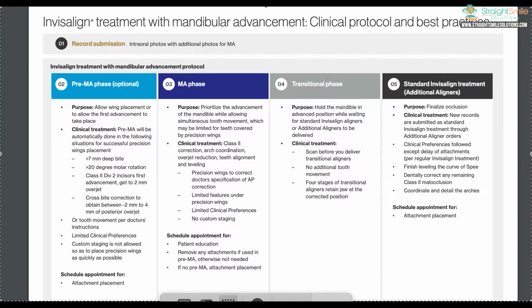Also, I've seen a bunch of cases done by quite a few doctors, and they all were terrible. Like terrible outcomes. They all needed revisions, refinements. I think that clearly Invisalign didn't have enough cases under their AI. This is just my personal opinion. And they're accepting cases that needed expanders first. That really was the key. Once you expanded them out first, then it worked out.